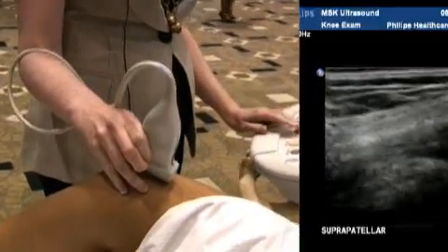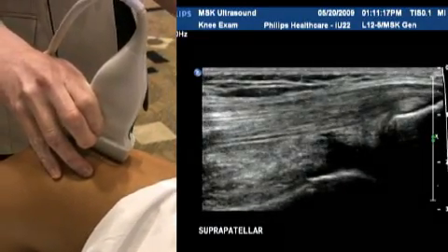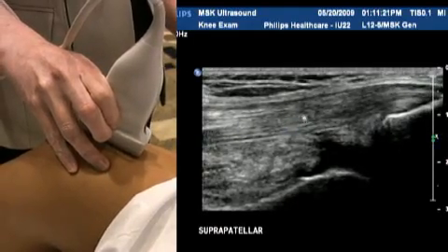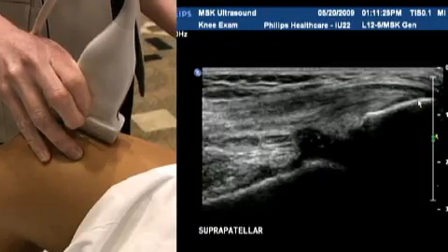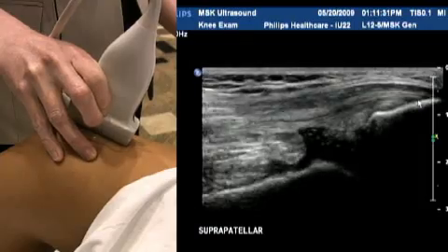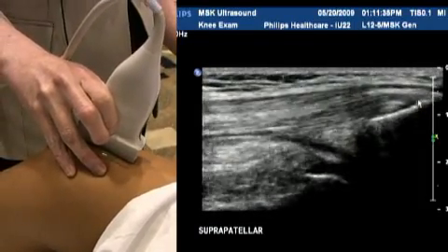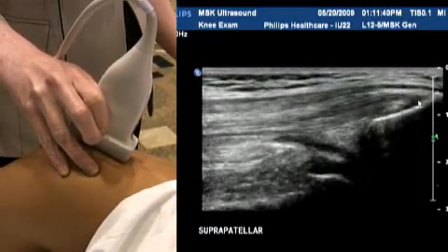I'm going to start in the suprapatellar area. You can see the quadriceps tendon attaching onto the patella at its superior portion, and we scan through medially to laterally making sure we cover the entire tendon. It is quite a thick tendon and quite a wide tendon side to side.